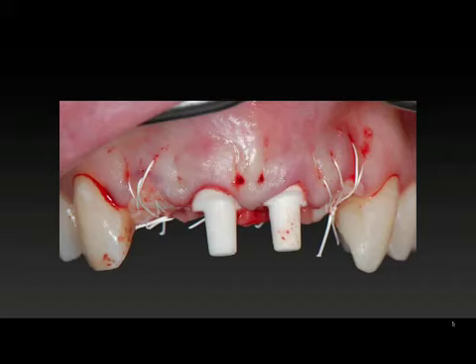It's not the same fears as with 2 4mm titanium implants. In this case, it would be very, very difficult to get an ideal result. Whereas with these materials, the options are much greater. So this is at the time of surgery.